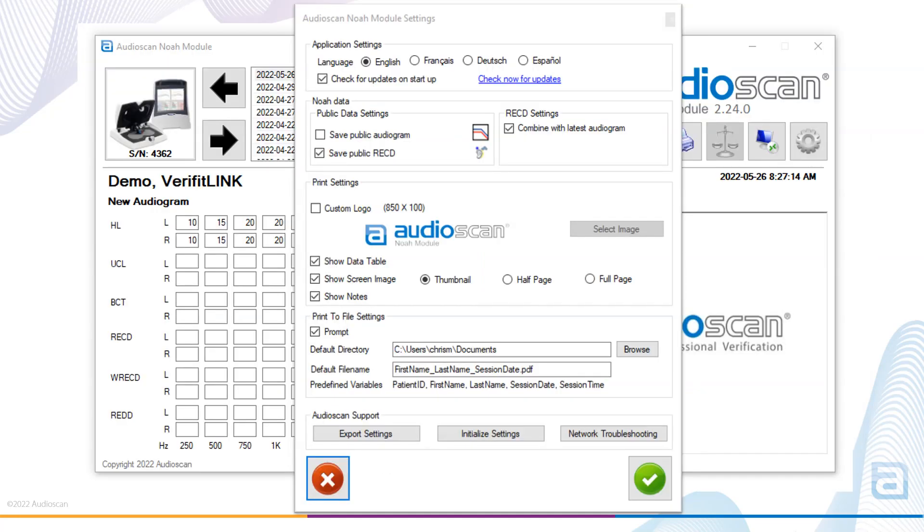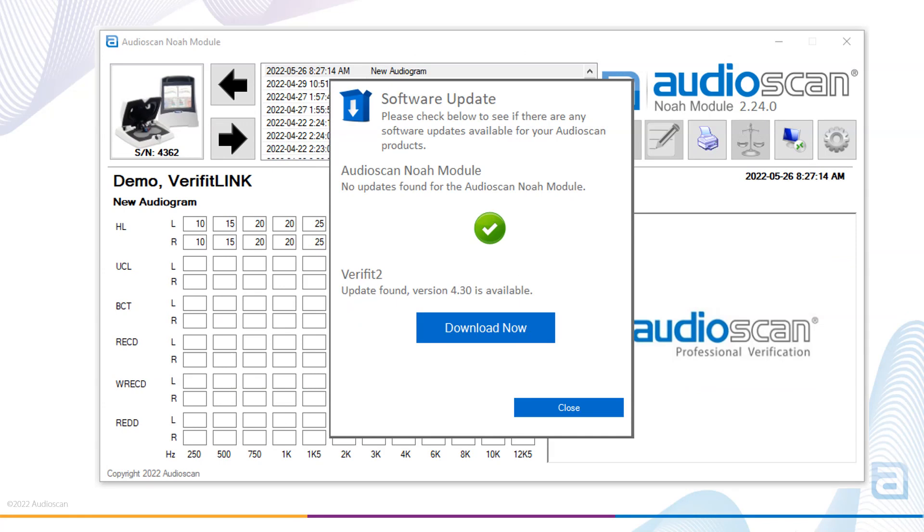If there is a checkmark beside check for updates on startup within settings, the Audioscan Noah module will connect to our website and check the installed software versions versus the latest software from our website. A pop-up will appear within the first minute or so of opening the Audioscan Noah module, indicating whether new updates have been found for either the Noah module or for the Verifit 2 or Axiom software. When a new software update has been found, a download now button appears.